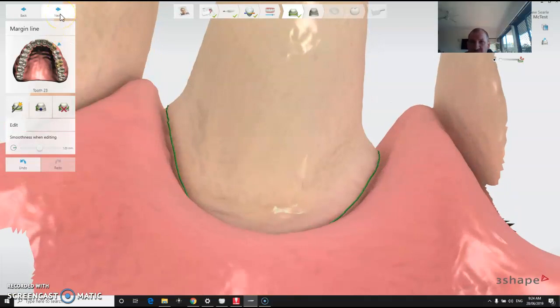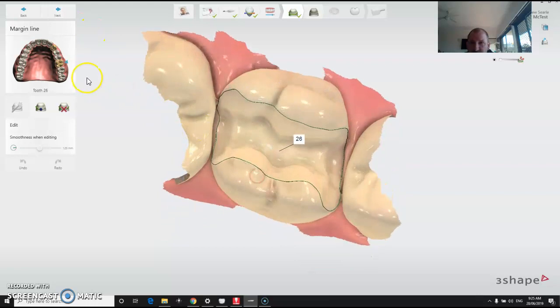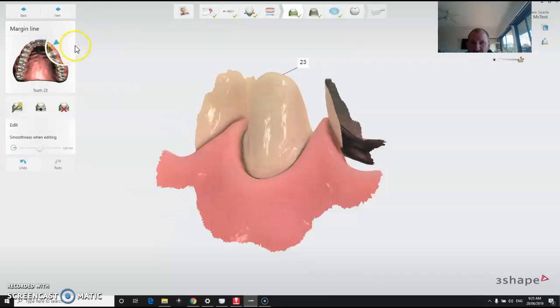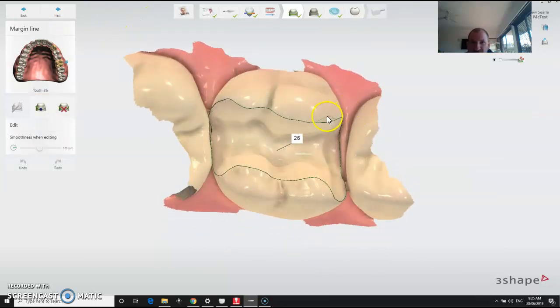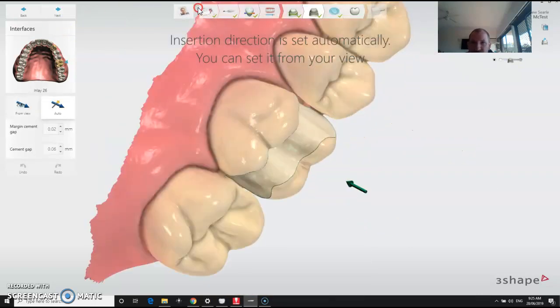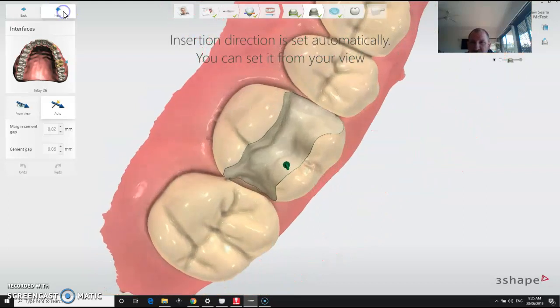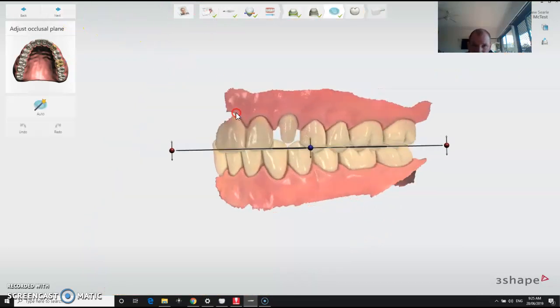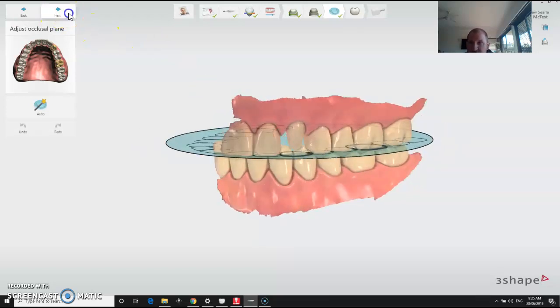After you've drawn the margin, it's going to set the path of insertion on both teeth. The next step — once you've corrected the margin line — is path of insertion, which it should figure out itself. Then you've got the occlusal plane, which you set up. Then hit next.